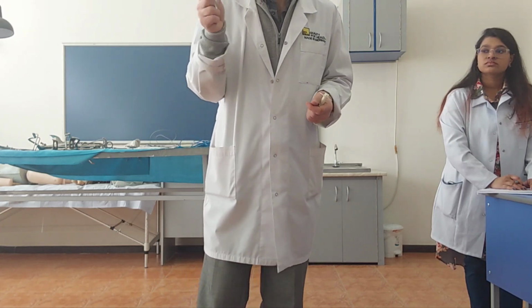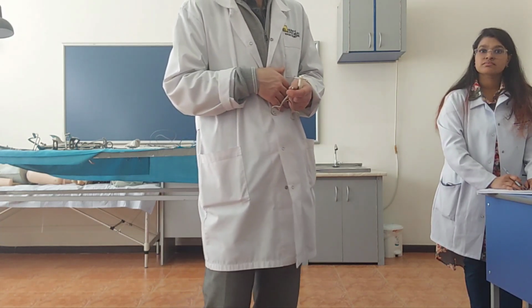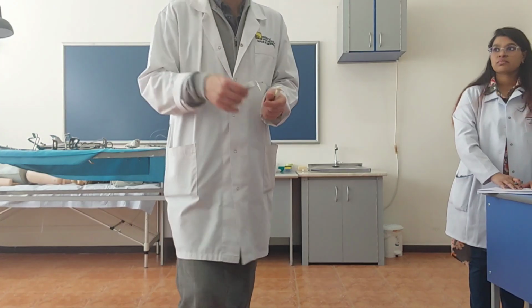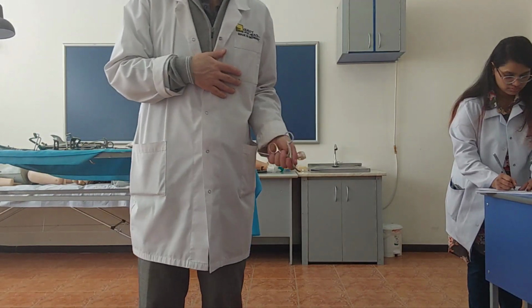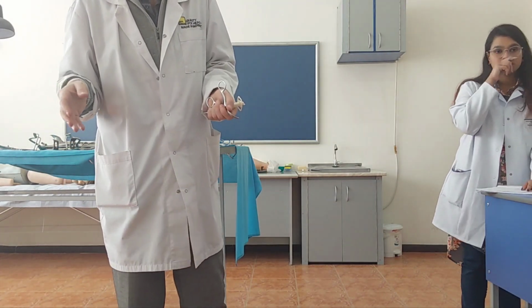These specific instruments we can use only during technique. That is not for access, that is not for sutures, that is for techniques. Let's say this is the biggest group in surgery because you understand how many branches of surgery we have. Stomatological surgery, urological surgery, neurosurgery. It's not even clever to name each branch now because we have, I can say, 100 branches.